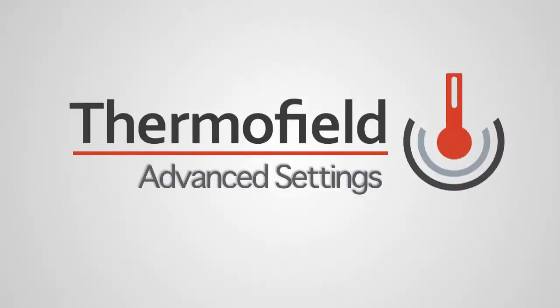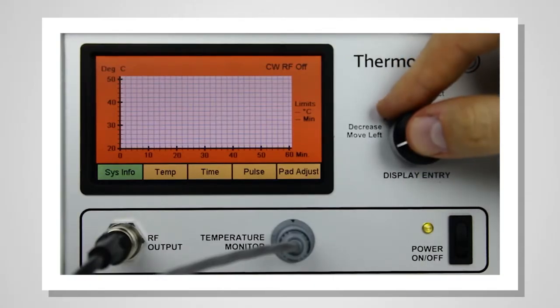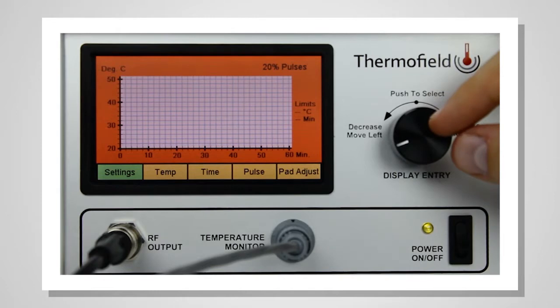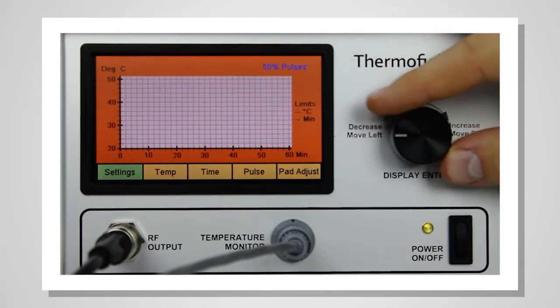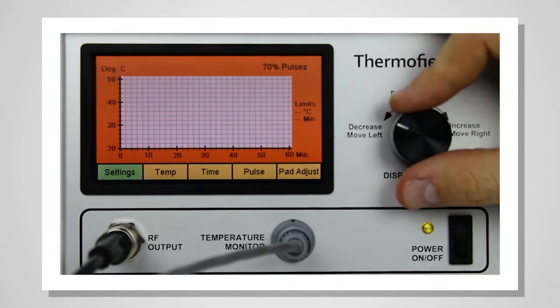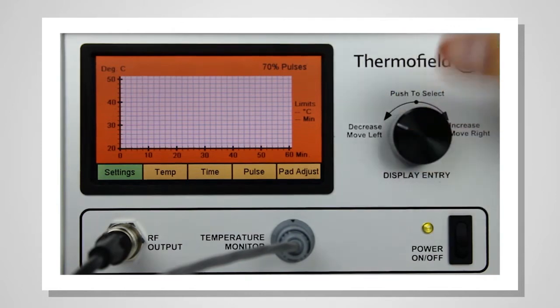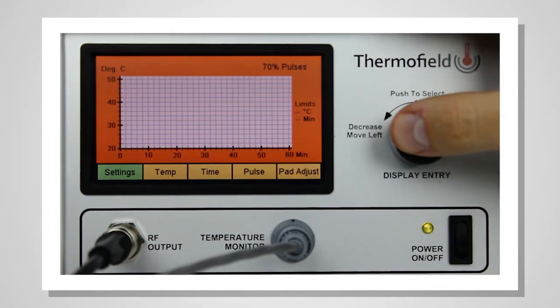The unit also has several advanced settings. To adjust the advanced settings, turn the knob and select the SYSTEM INFO pane. Once you push the knob, the pane will read SETTINGS, and the settings will appear in the top right corner of the display. Turn the knob to view the settings. Once you select the desired setting, it will change to blue.